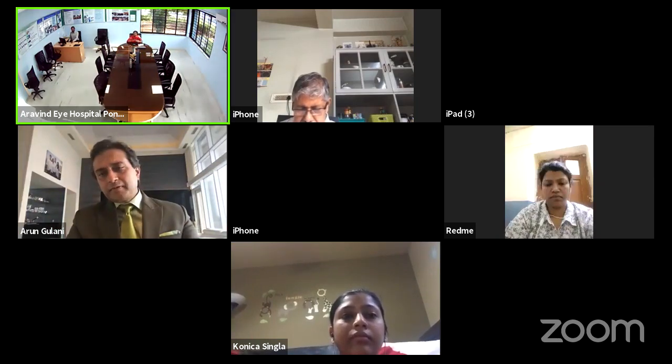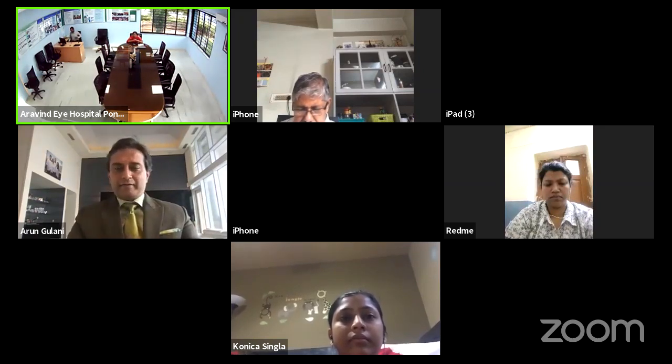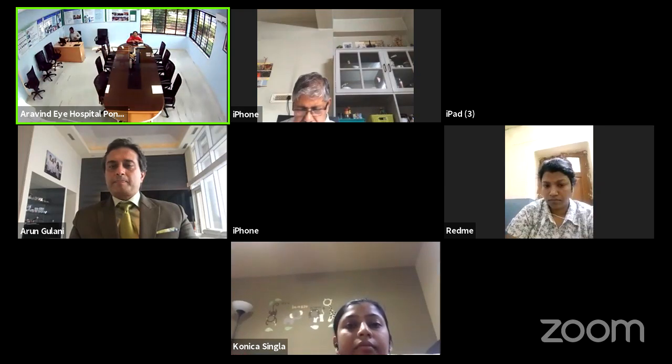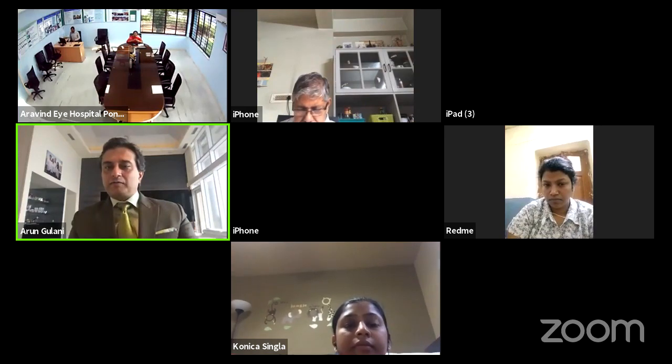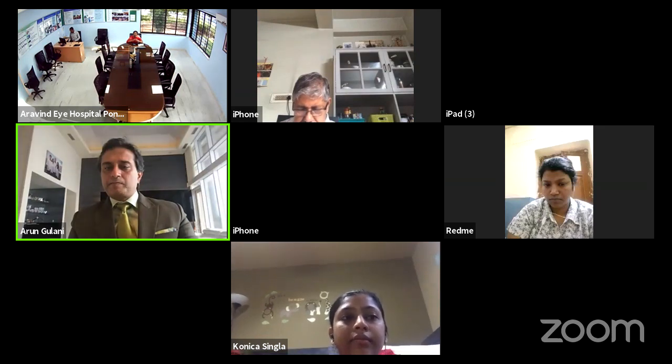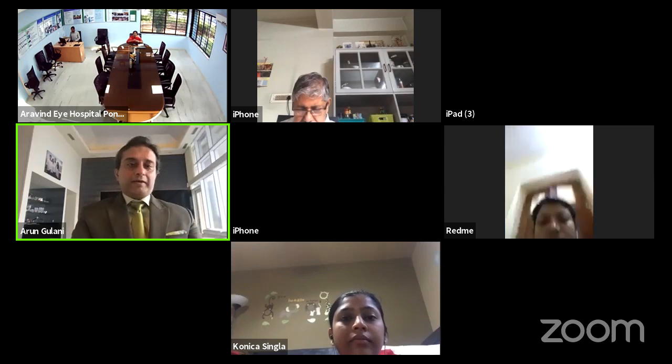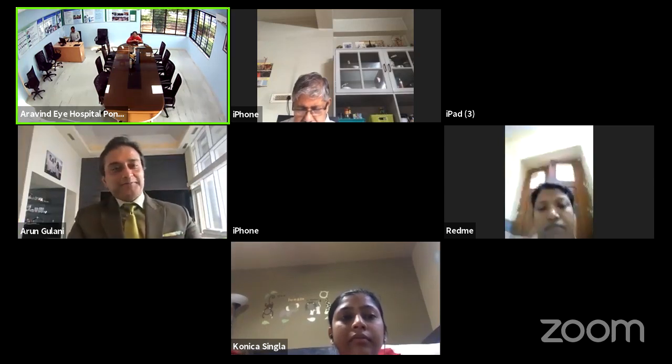Hello? I can't hear. So we're not able to hear you, Dr. Anita. I'm looking at the chat while I'm waiting. I think I've answered all of these questions. Minimal redness and good vision for me, sir. This is Sonali, okay? Yes, not minimal, no redness. Audience, any other questions do you have?